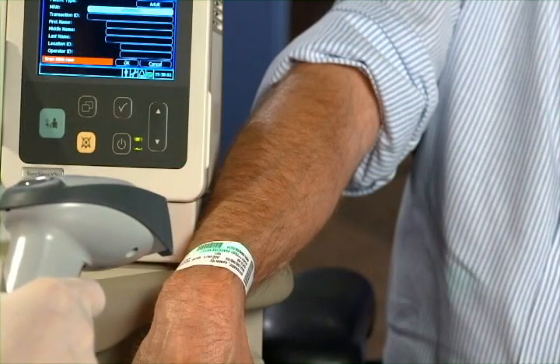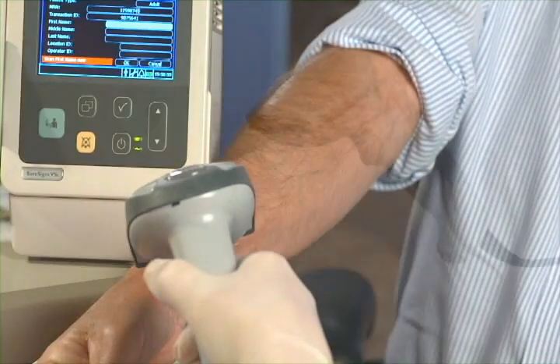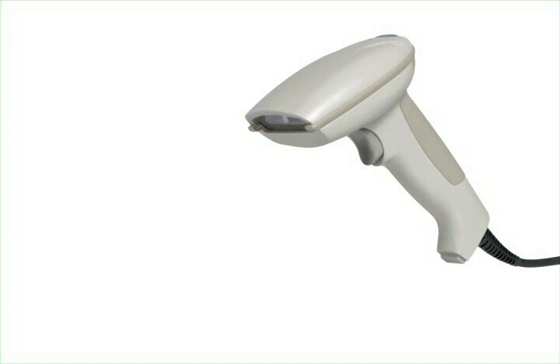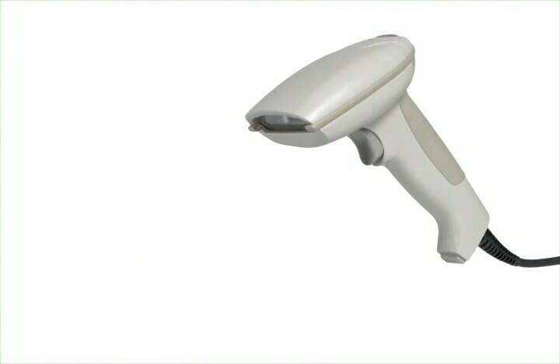If you have a barcode scanner, you can use it to enter patient information. There are two types of scanners, one for reading individual barcodes and a programmed version that automatically transfers the scanned information to the corresponding patient ID fields. Their operation is similar. In this case, we'll use the one for reading individual barcodes.